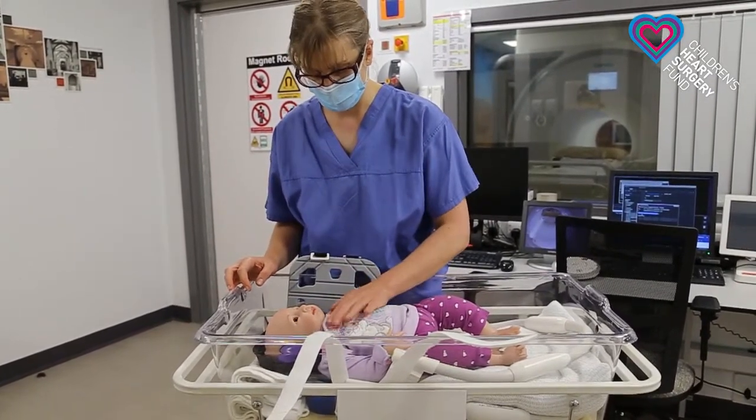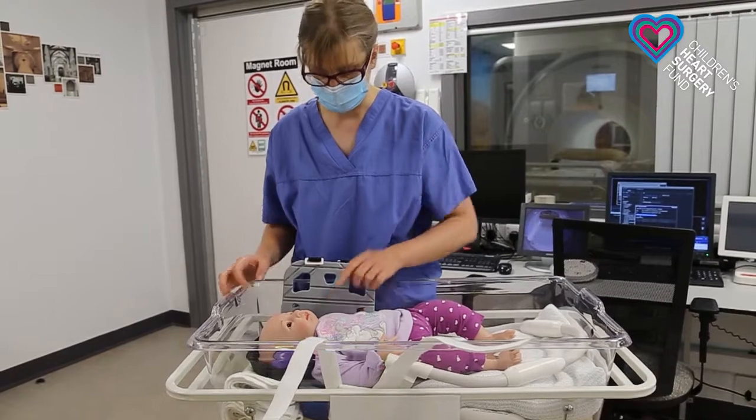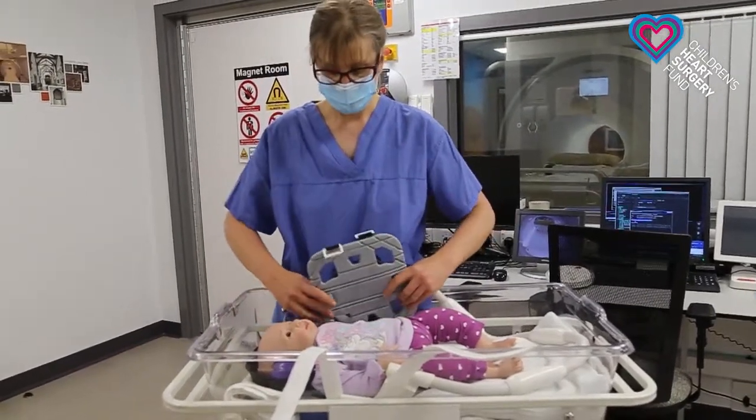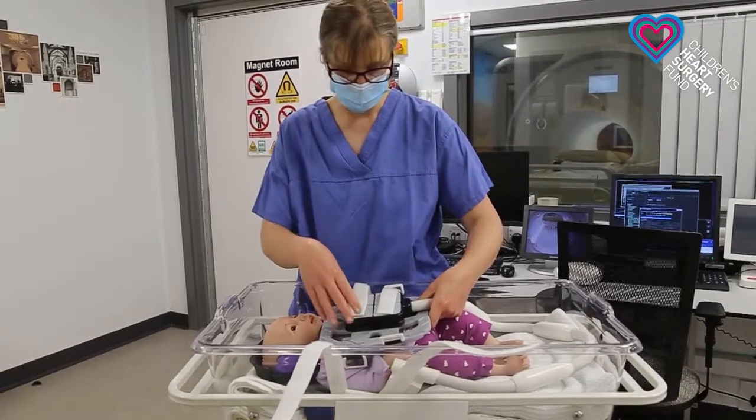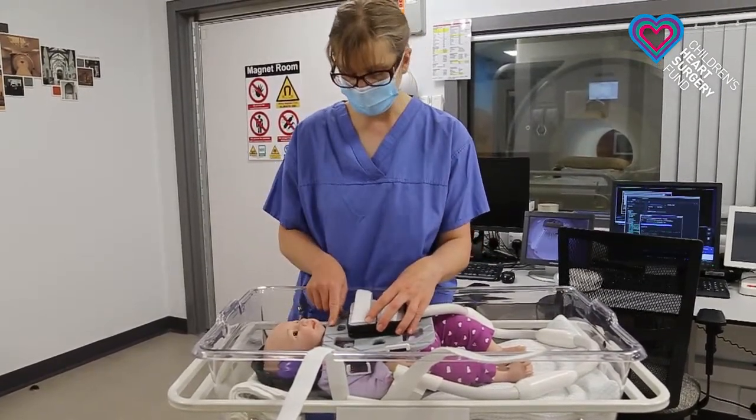It's very important to remember that the big blood vessel actually goes all the way up to the neck, so we then position the other coil just underneath the neck to have it nice and comfortable.